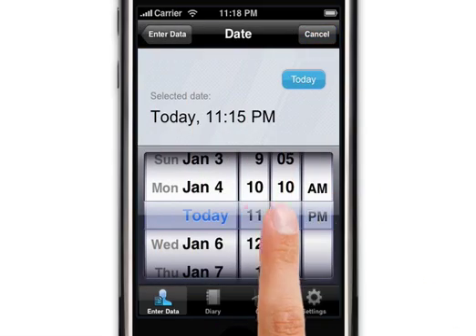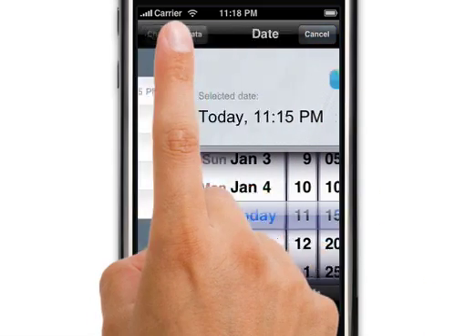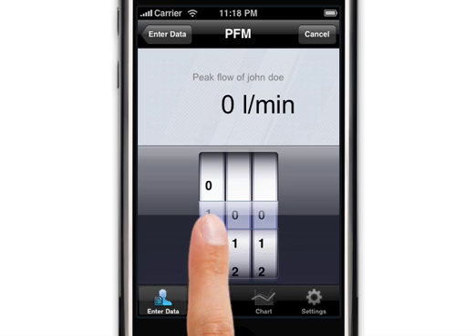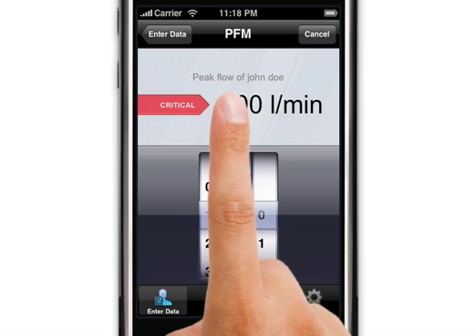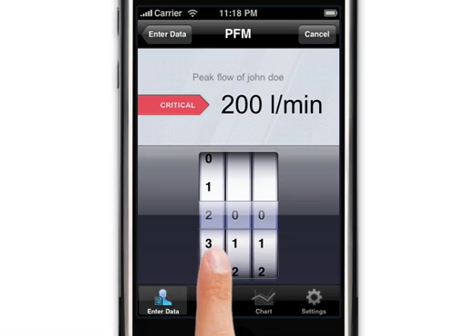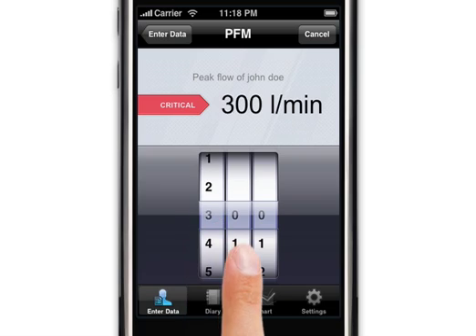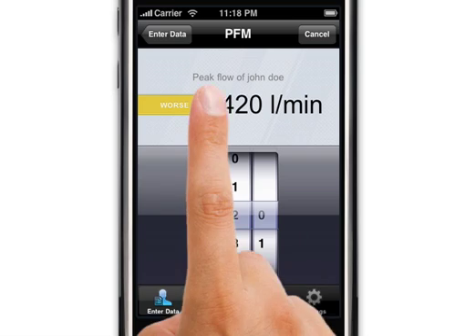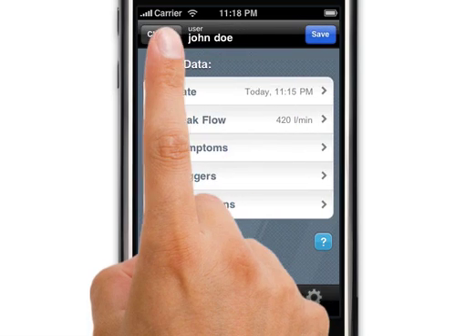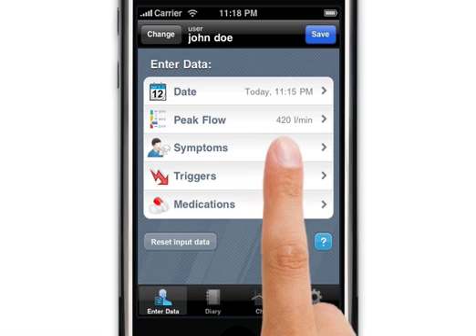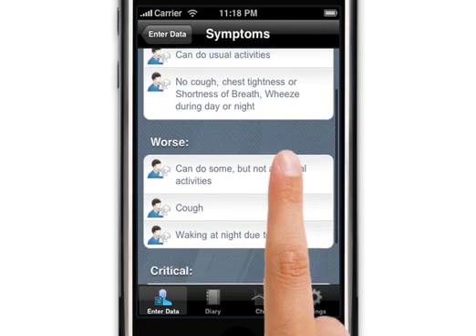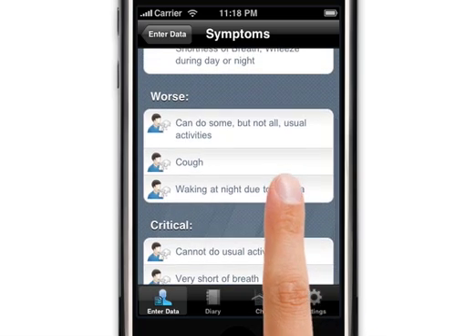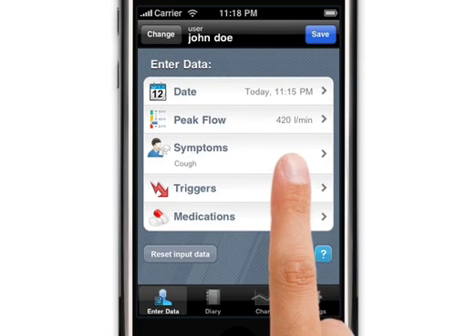Next, we're going to be entering data. First is by entering the information on the date, which is by default today's date, but you can always pick and choose that date as necessary. Next is the peak pulmonary function. As you change the numbers, you can notice the zone color changing. You can see the peak flow meter measurement on top. This is your symptom list. You can look at the list of the symptoms and pick the worst symptom you have at the moment.